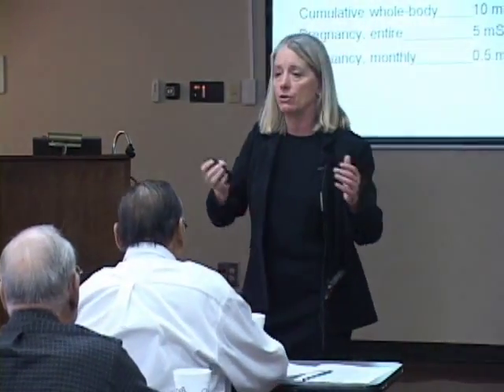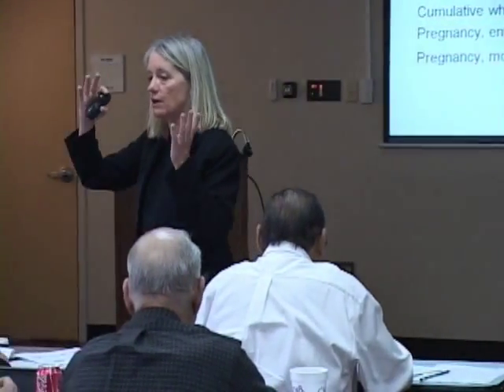So if you look at all 3 units, let's look at a roentgen, a rad, and a rem. If we're talking about X-ray, they're all 3 equal. That's why people are so cavalier about using them interchangeably. Oh, they got exposed to 1 rad of radiation, or they got exposed to 1 rem of radiation, or they got exposed to 1 roentgen of radiation. Really, the only incorrect unit that you'd be using there, if it's not an occupationally exposed individual, would be the rem. Rem is usually reserved for your monitors, for your film badges and your personnel monitors. But rad and roentgen are used interchangeably when you talk about patient dose.